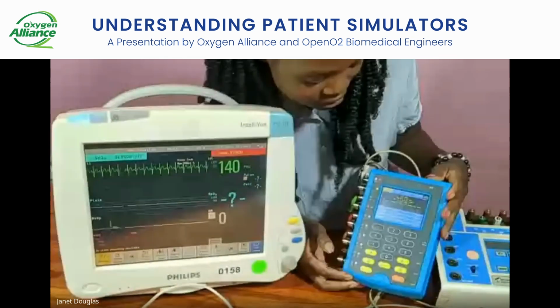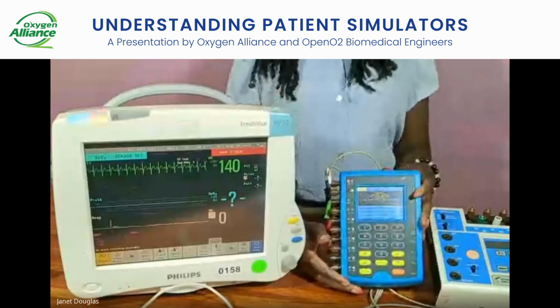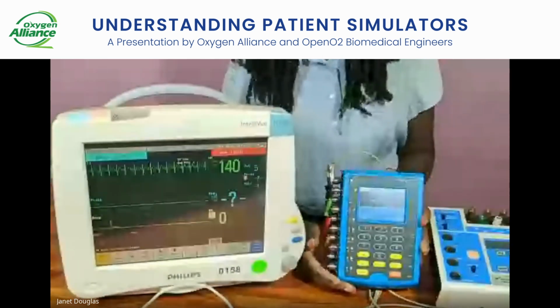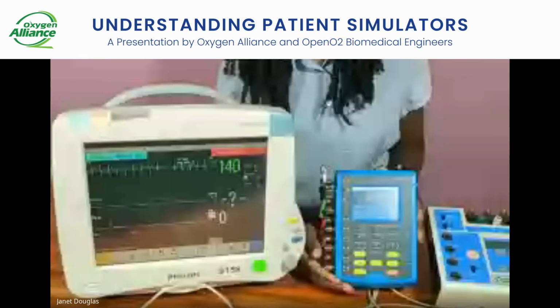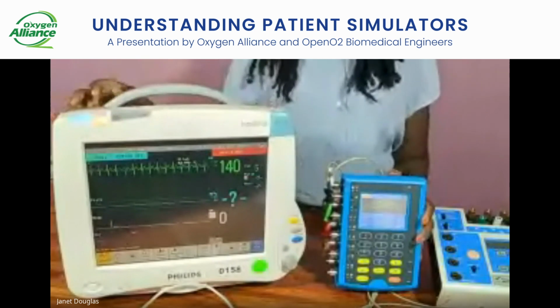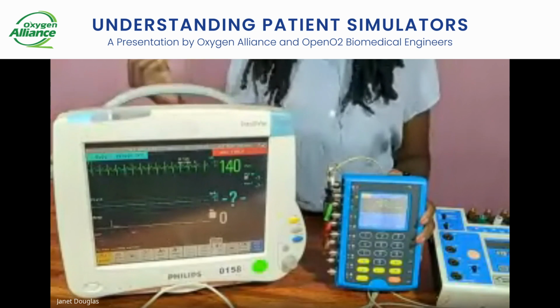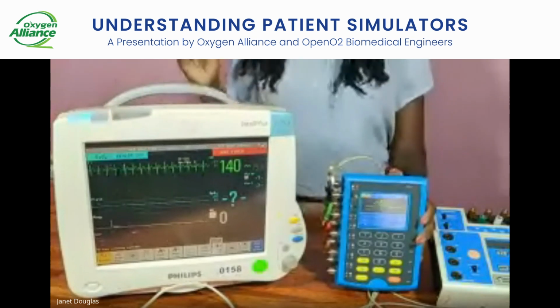Since the ECG rate is giving me 140 beats per minute, and this is not normal for a patient, that's why you're seeing the monitor itself giving out alarms, activated that there's something wrong with the patient.